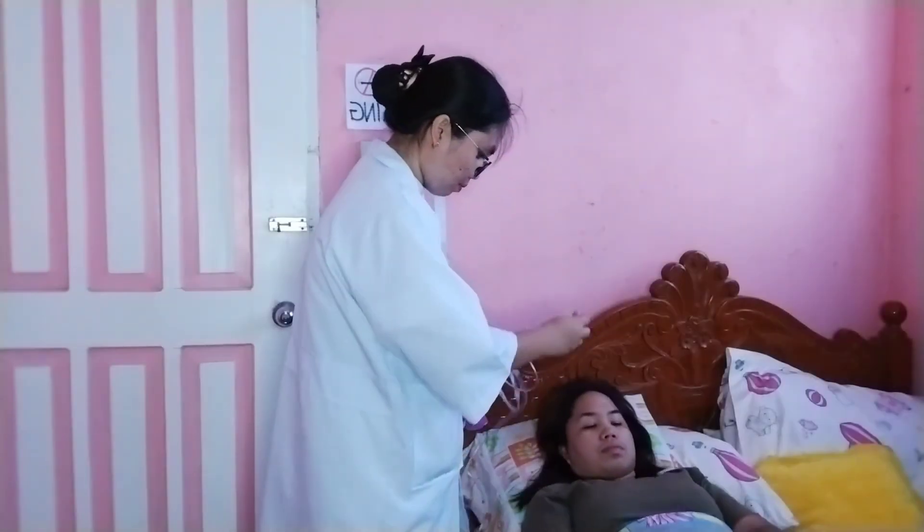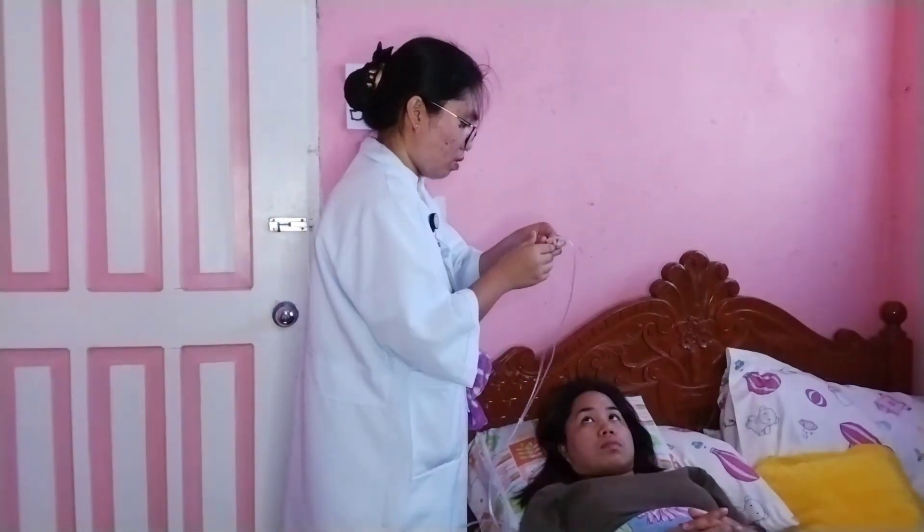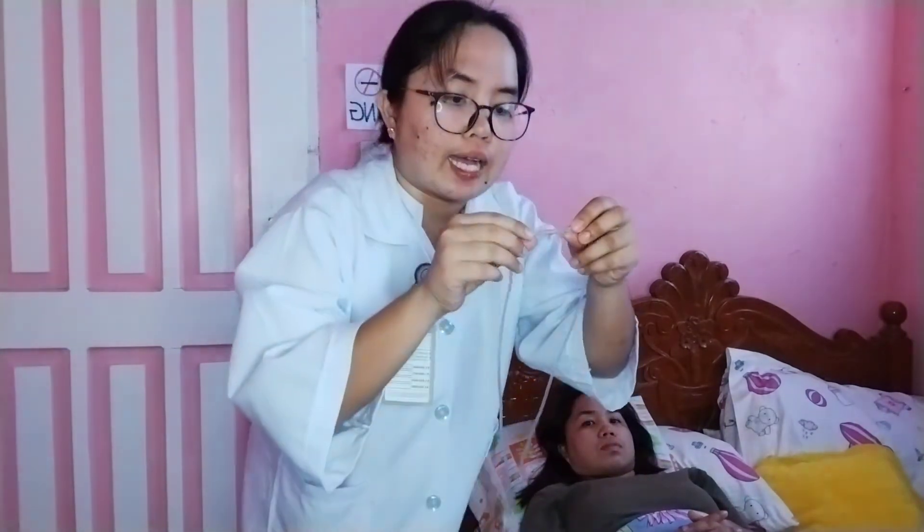Place prongs in the patient's nostrils. Loop the tubing over and behind each ear with the adjuster comfortably under the chin. Alternatively, the tubing may be placed around the patient's head with the adjuster at the back of the head. Place gauze at the ear beneath the tubing as necessary.